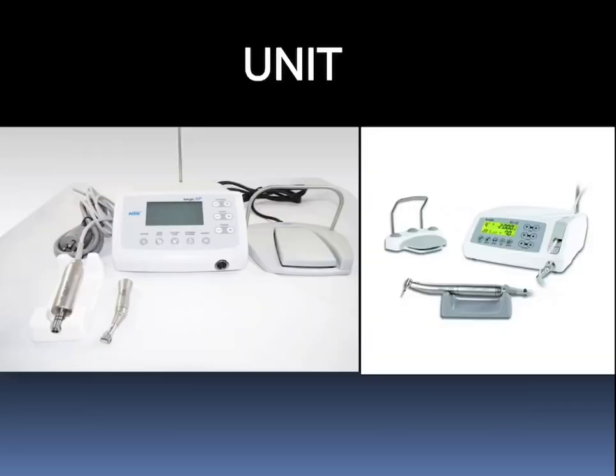Now this is the normal dental unit that has been shown, the implant unit, which is also called the physiodispenser unit. It consists of a foot controller. It consists of a handpiece. This is how the handpiece is seen and this is the controlling panel. It consists of torque, it consists of RPMs and it shows at what unit this has been revolving.